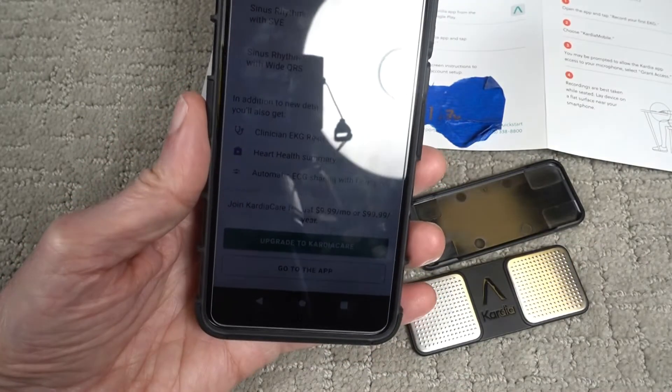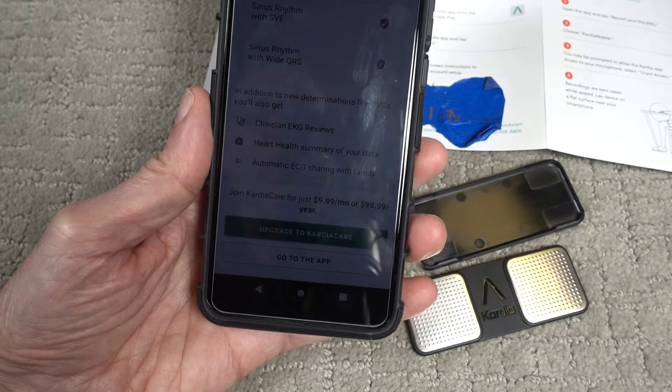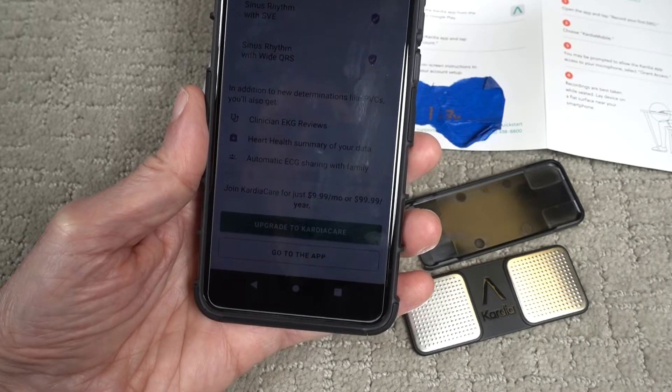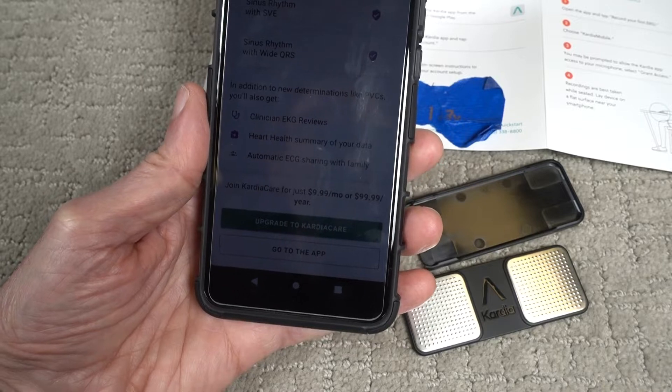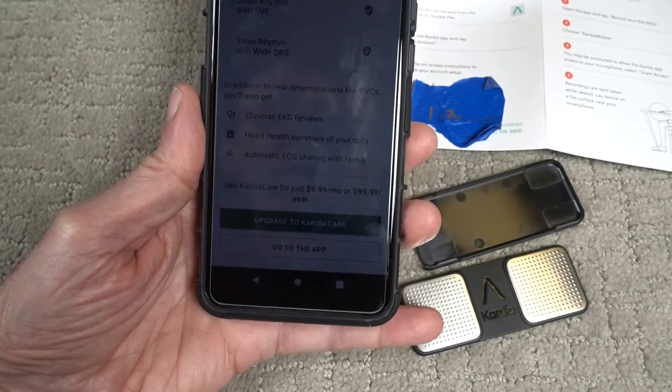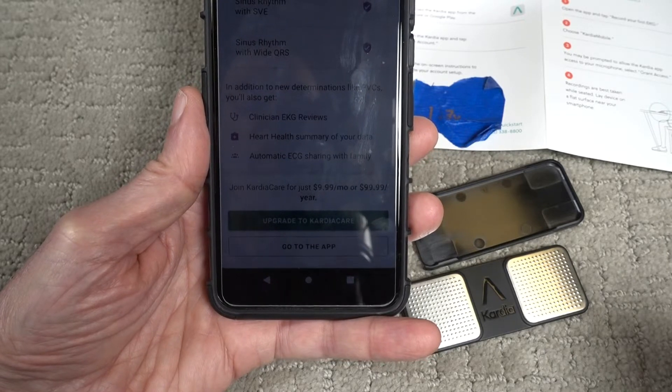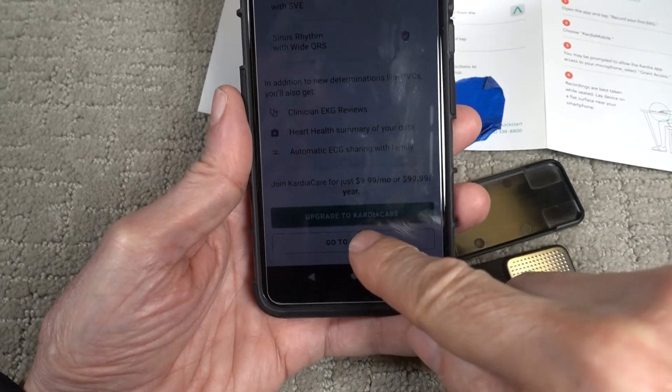So I put in my profile information, and I notice on the profile if you happen to be one of those sexes other than male and female, this is not going to accommodate you. So just a warning — you have to be either male or female in order to use this app.